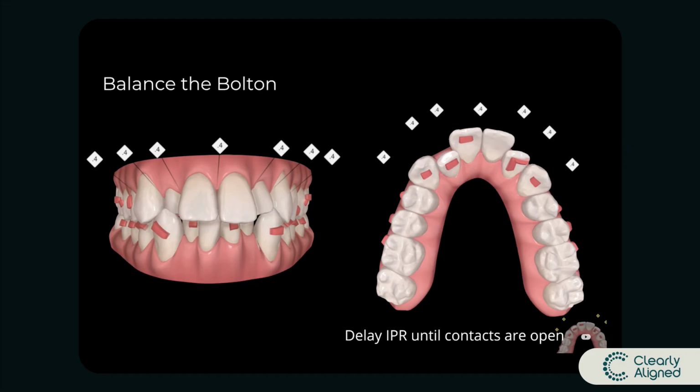Now, again, I know that's a more complicated topic, and I don't want you guys to stress about this too much. The main thing is we want to make sure the lid and the box fit together properly. If we're taking out a tooth on the bottom arch, that usually means there's going to be a bit more of an overjet, more space between the top and bottom teeth, or as normal people would call it, an overbite. Right?